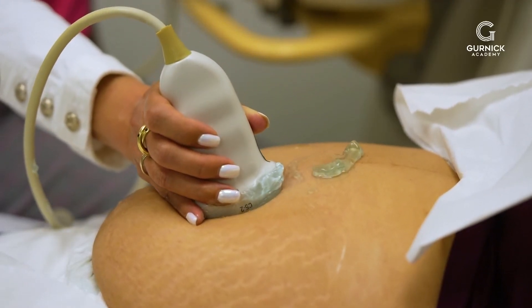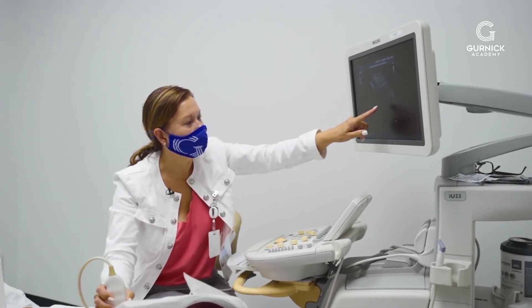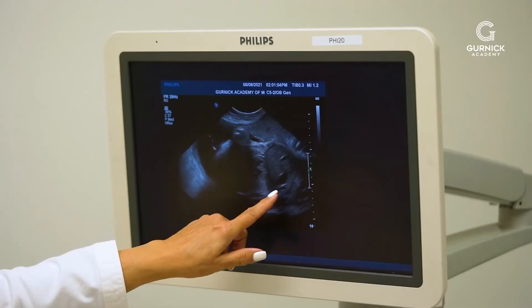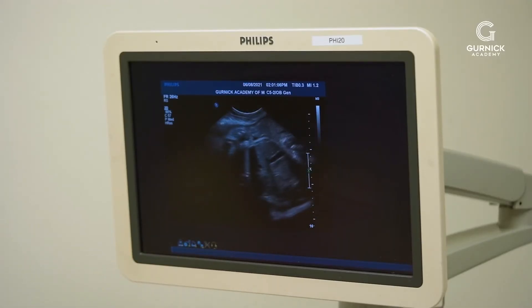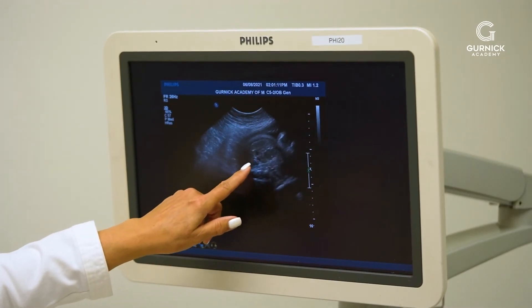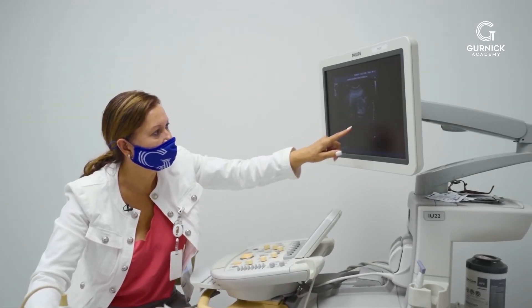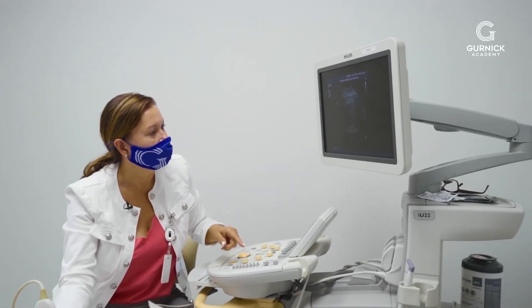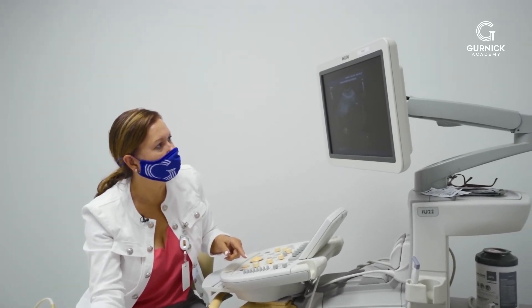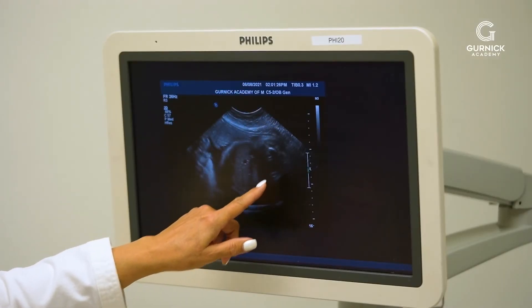There's baby's head, heart, and then as we go down, here's baby's stomach — nice and full — which means mom's doing a great job. You can see a kidney right here, and this is part of the spine. There's still some fluid in the bladder right there.